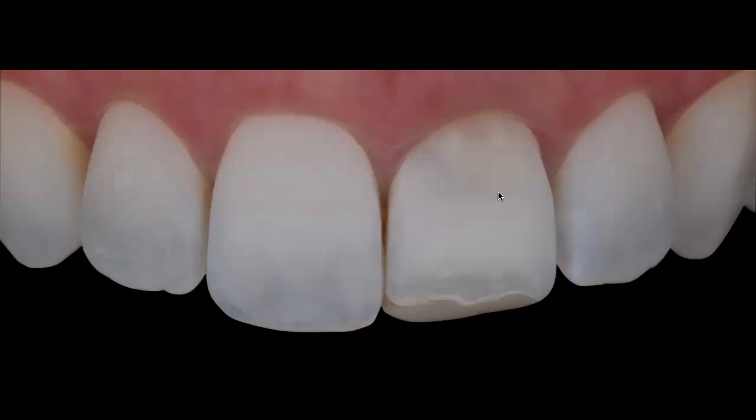Well, this at the end of the day ended up being something good for me because now I don't have to remove any of that enamel. I can actually bond. I have to add more material to restore that tooth to the right buccal contours. So that helped me be more conservative and not have to remove any enamel. And most importantly, on that cervical third, I already knew that the enamel was very, very thin, and I had no dentin underneath that area, because there were multiple different restorative materials underneath that enamel in that cervical area.